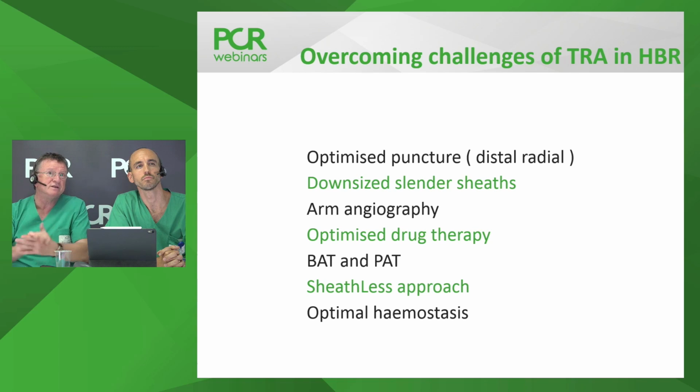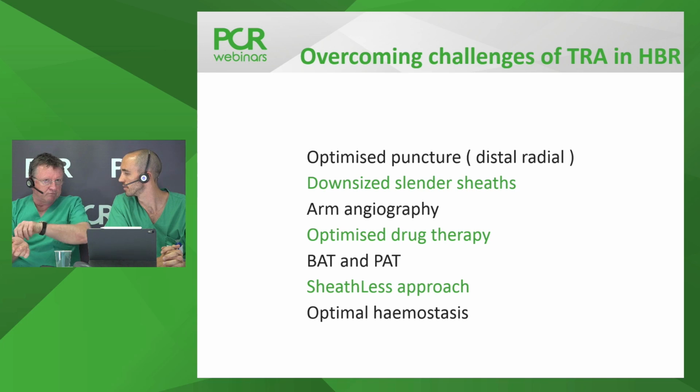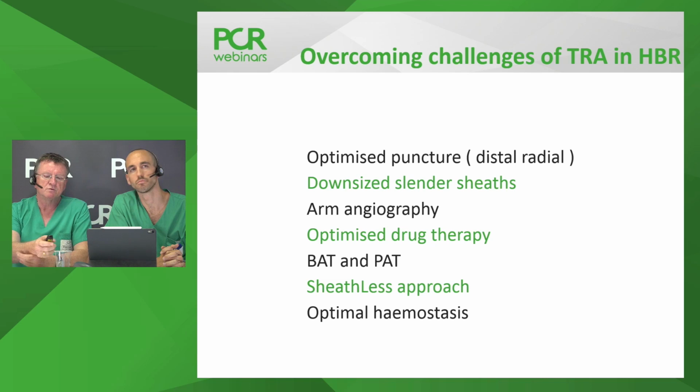And of course, at the end, you have to do the hemostasis properly with patent hemostasis. Do you use manual compression for radial access? We use the TR band in some cases, and we also use a different device with a rotating bezel. Our nurses will then use the oximeter and check for patent hemostasis. And I see very little radial artery occlusion these days with those kinds of approaches. So there are many different technical issues to consider, really.